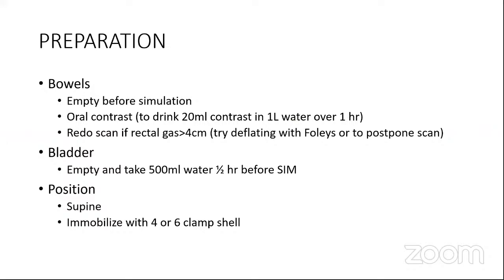Of course, I'm not going to stick to one particular protocol. We will discuss the general principles of contouring. To do a good contouring, we need a good simulation image, and to have a good simulation, we need to prepare the patient adequately. Of course, most of you would have been doing this in your hospitals. I'm just refreshing it so that we have a general idea, and there will be minor variations between institutions.